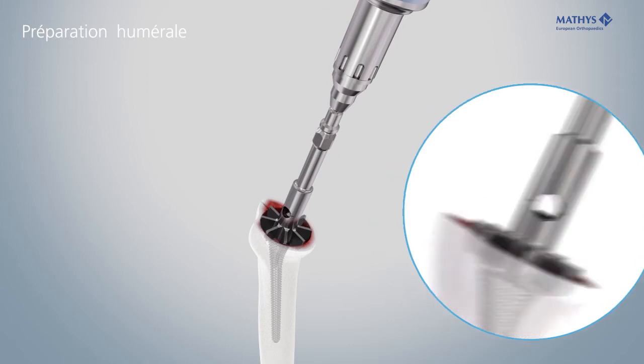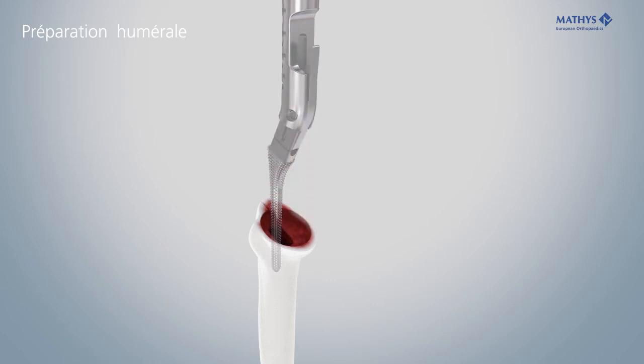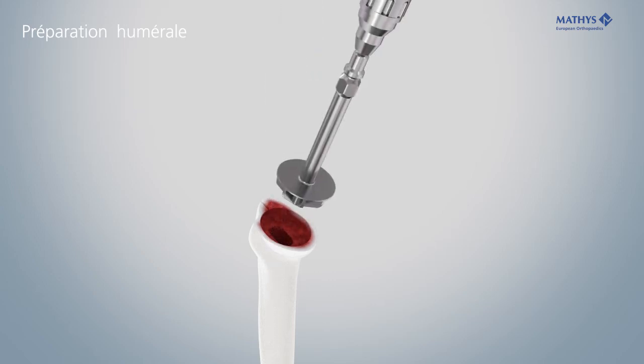To complete the humeral preparation, remove the rasp and finish the reaming of the metaphyseal cavity with the humeral reamer 2.